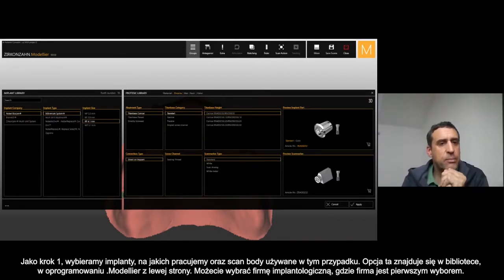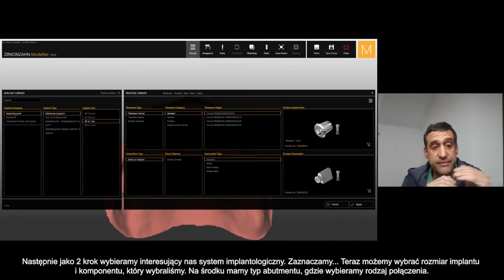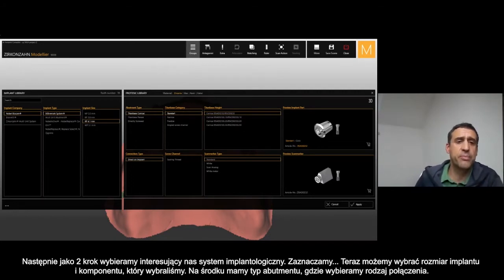Select your implant company, and then you have the second choice — the implant system. So the different implant systems that this company has, you can select it. Then you have the implant size related to the system that you choose.